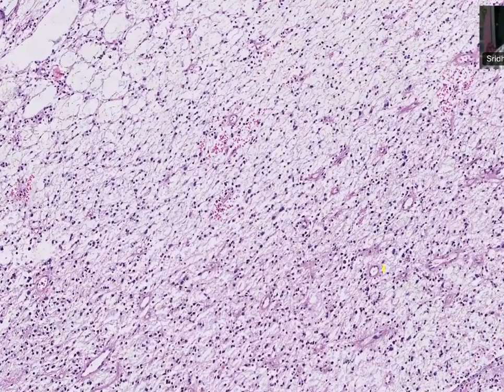The given picture shows a microcystic background. There is vascular proliferation as well. Proliferating blood vessels rather than vascular proliferation, because there is no layering. It's just proliferating blood vessels. Then what is this area showing in the same tumor?